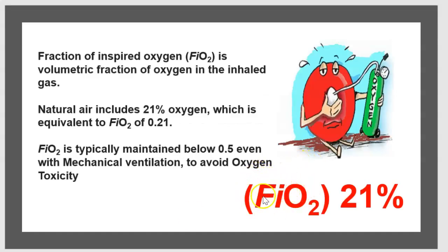FiO2. What is FiO2? Fraction of inspired oxygen is the volumetric fraction of oxygen which is inhaled as a gas. Natural air includes 21% oxygen, which is equivalent to an FiO2 of 0.21. FiO2 is typically maintained below 0.5, even with mechanical ventilation, to avoid oxygen toxicity.